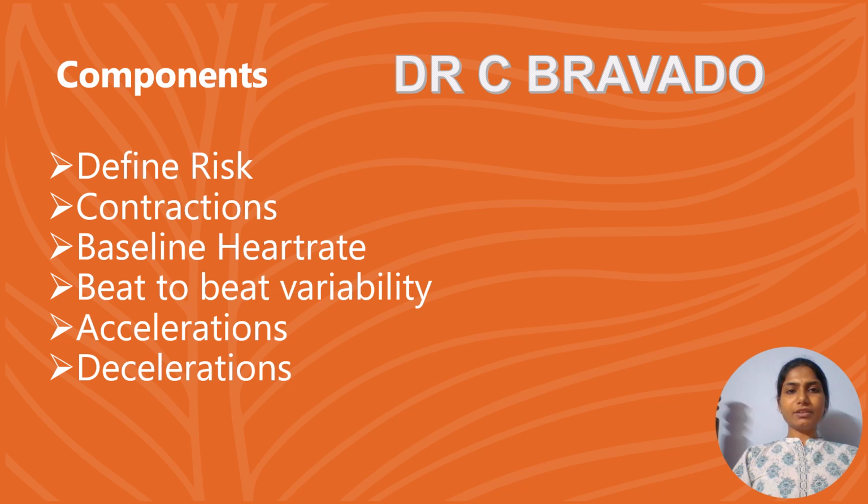Next, moving on to the components of CTG, whether it is an antepartum assessment or an intrapartum assessment. We have this mnemonic, called Dr. C. Bravado. So what is DR? We have to define the risk, whether it's a low risk pregnancy or a high risk pregnancy. Presently the Cochrane review tells that antenatal assessment of fetal well-being based on CTG alone is not that indicated in a low risk pregnancy.